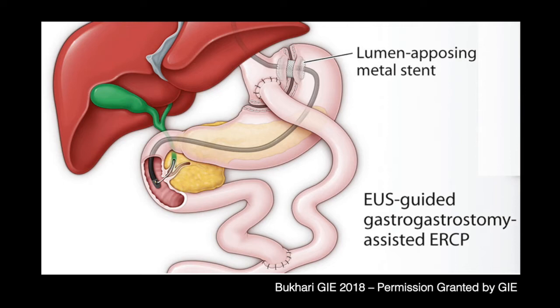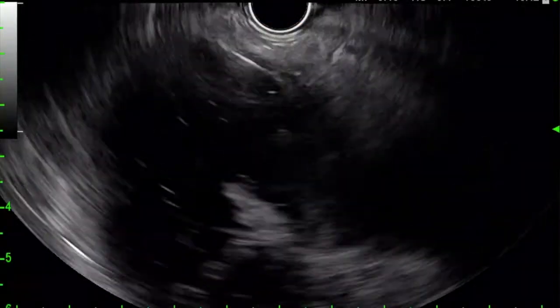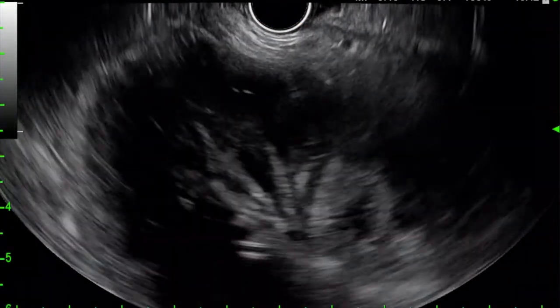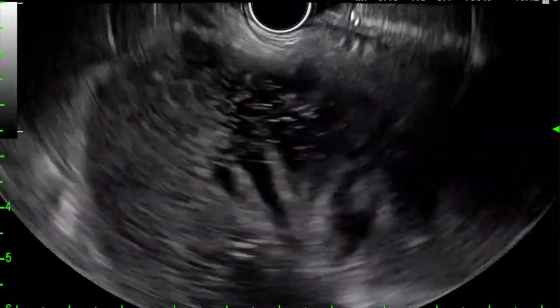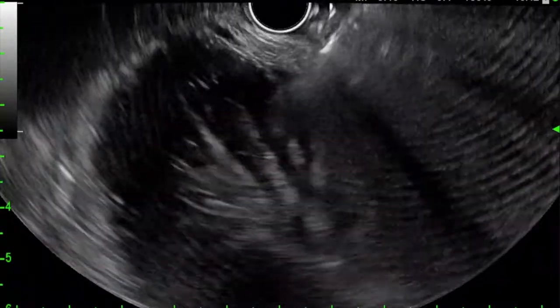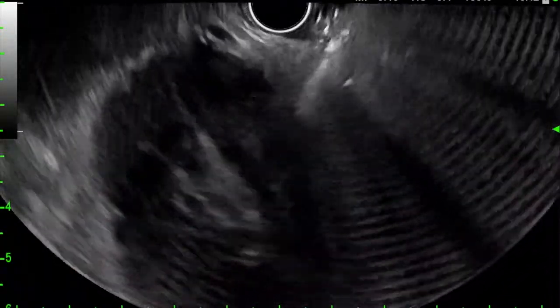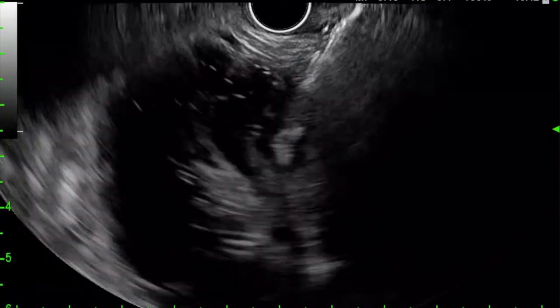The patient elected to undergo EUS-guided jejuno-jejunostomy using a 15-millimeter lumen-apposing metal stent, subsequently followed by trans-jejunal ERCP. To aid in the creation of the EUS-guided jejuno-jejunostomy, we injected a combination of saline and contrast using the indwelling percutaneous biliary drain to allow for distension of the small bowel and create a target for EUS-guided access.